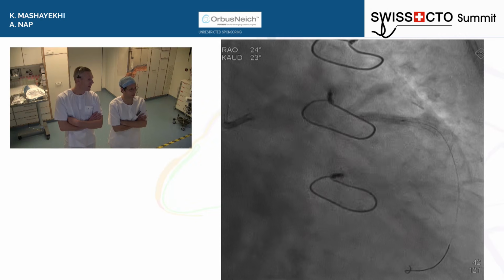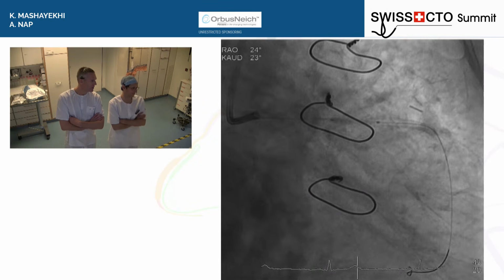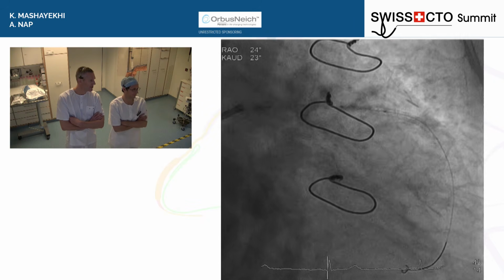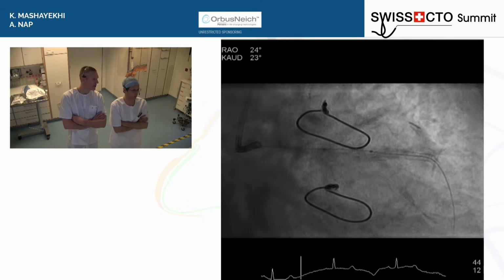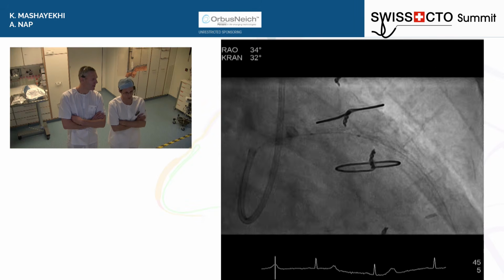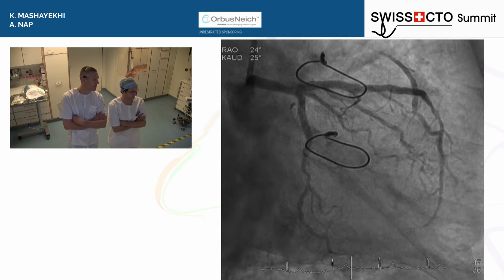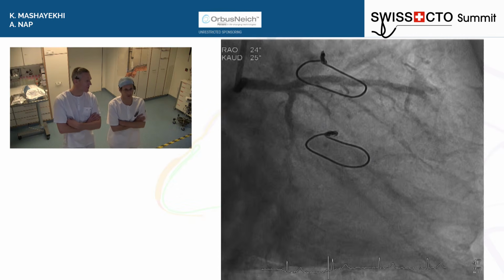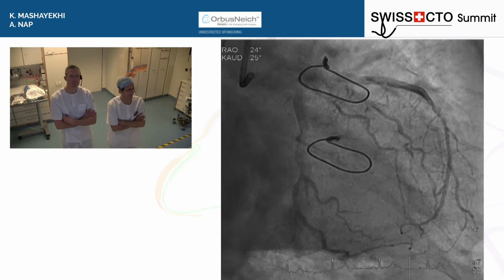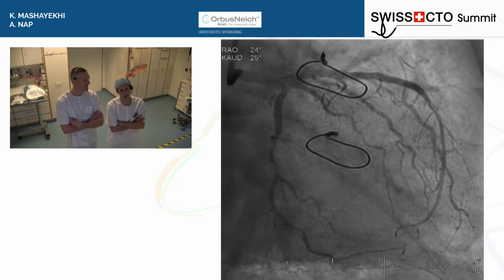Okay, next image, please. And we post-dilated the whole LAD, and the result is beautiful. Just the last result, please. That would be so great for the people. I mean, we know that it's okay. Yeah. This one. Okay. So the circ was stented, the LAD was stented, and I think it's okay. Yeah. Thank you very much. Thank you. Yeah, very nice outcome. Okay, see you. Very impressive. Thank you very much. Thank you so much.